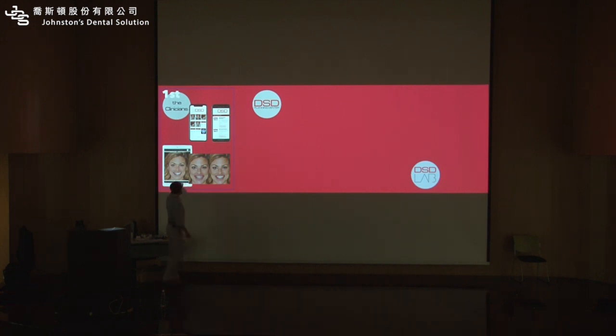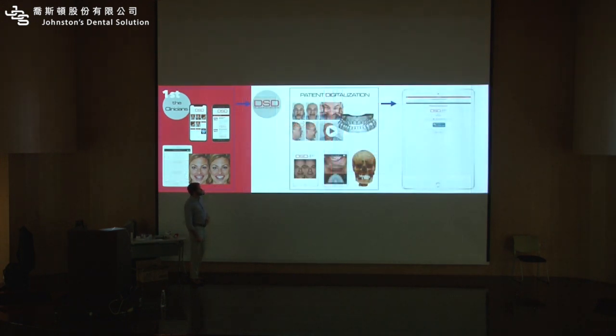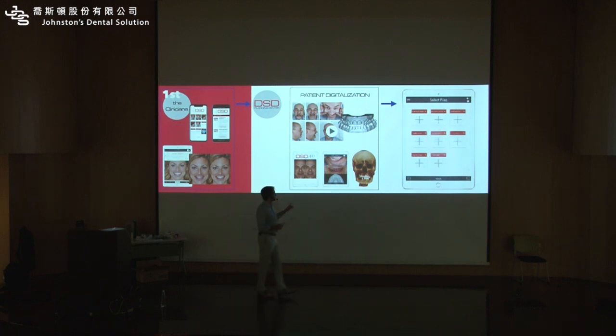Another thing that I can do on the first appointment is the smile simulation in 2D for the patient. Okay, we're going to show this right now. And if you do a 2D simulation, this can work as a starting point for us to do the 3D. So as you do the 2D, we can do the 3D based on your 2D. If you don't do the 2D, no problem at all. We will do everything. So don't worry. Okay? So this here you see.